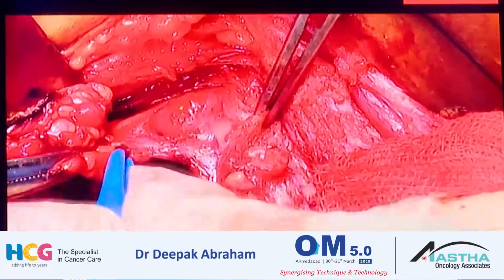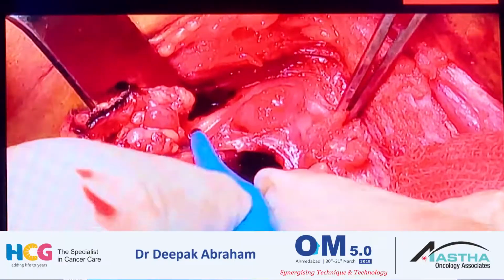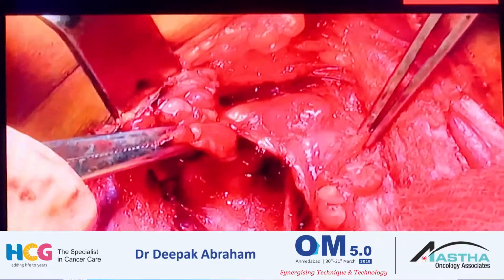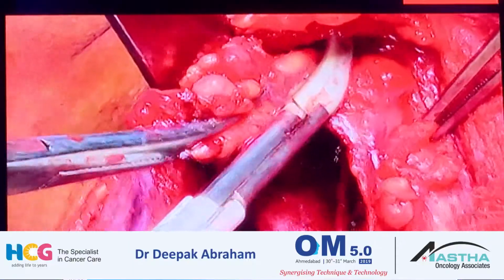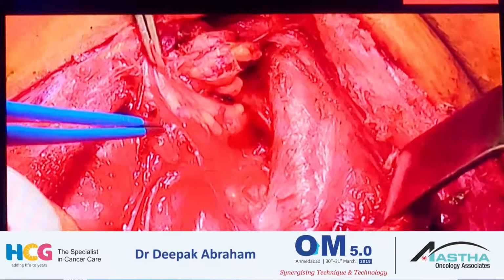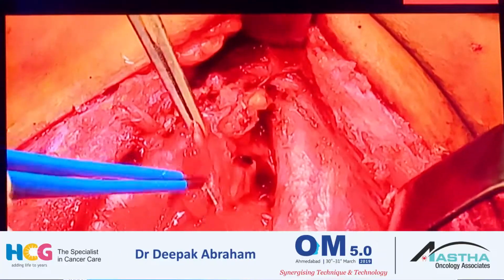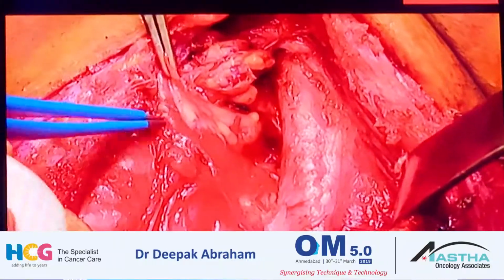And that's the thymus. That's the end of the horn of the thymus, and we don't go into the thymus. If you're doing a metastatic MTC or you're doing a thyroidectomy for MTC, that also comes off. So that's the nerve below, and that's thymus, and all of that comes off. So that's the vascularity to the parathyroid being dropped down. That's the vascularity to the parathyroid.